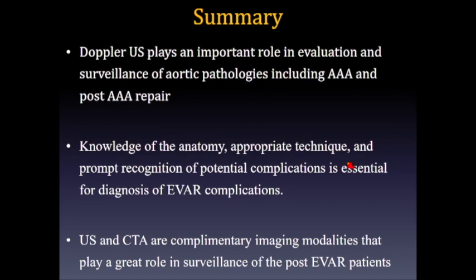aneurysmal sac. So as a summary, I just wanted to say that Doppler ultrasound plays an important role in evaluation and surveillance of aortic pathologies, including AAA and post-AAA repair, and knowledge of anatomy, appropriate technique, and prompt recognition of complications is essential for diagnosis of EVAR complications. And ultrasound and CTA are complementary imaging modalities that are great tools for surveillance of patients after EVAR.